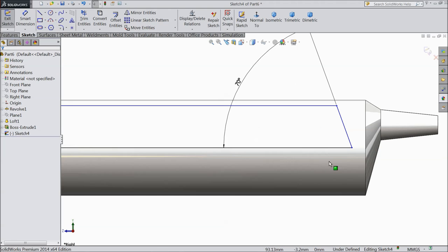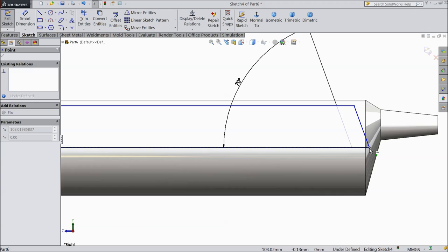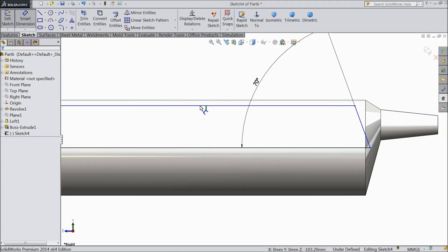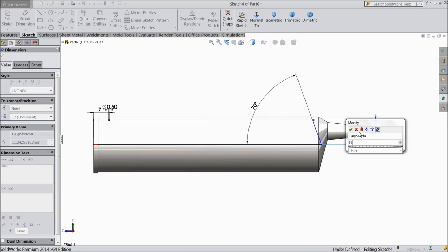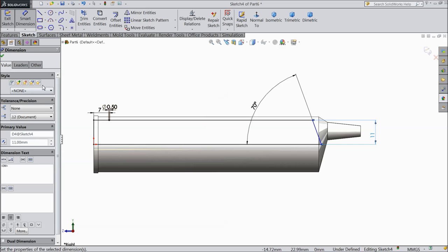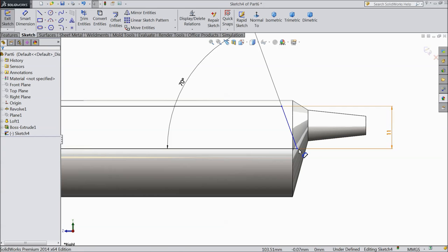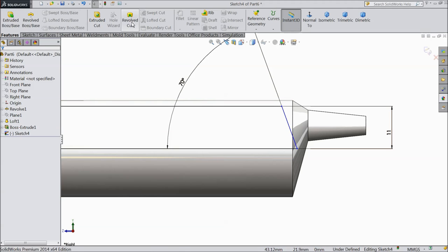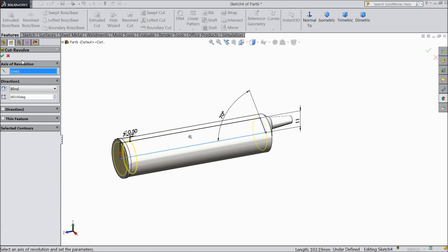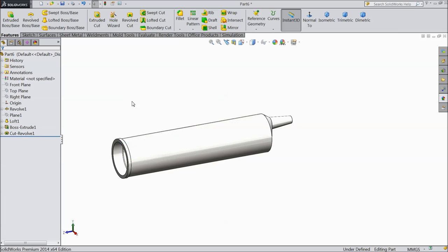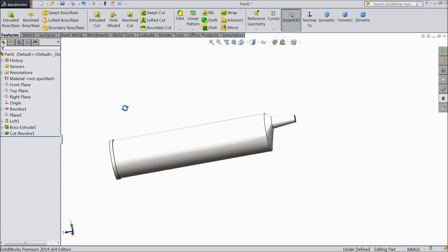Now just drag this point a little inside. Select the center gap and keep 11mm. Now select revolve cut and select this line as an axis. Now see — it is hollow, it is cut.